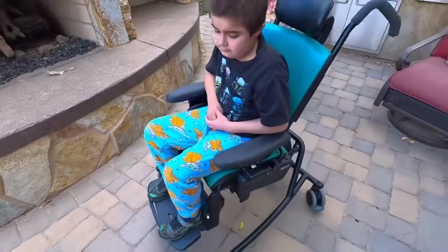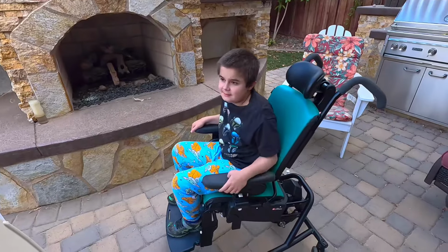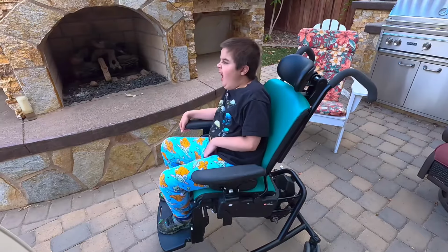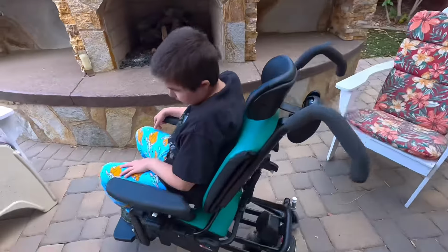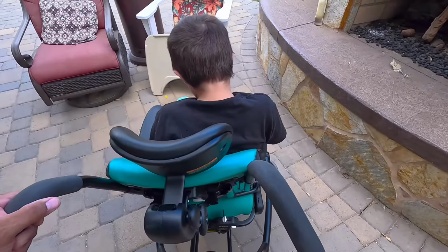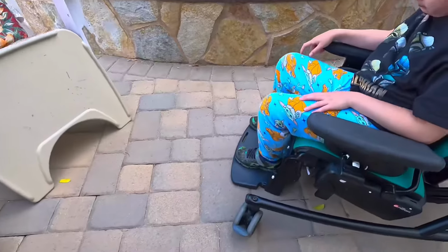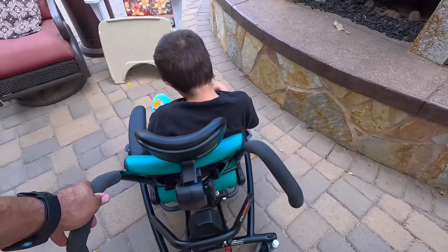Now this is where it's a little different. Billy has lost a lot of strength, and so in order for him to get out of the chair in the best way possible, he has to be precisely 5 pumps from floor level. So the first step would be to drop the chair all the way to the ground level, which we'll do right now. And you can see that the chair is all the way at the ground level, and now we'll pump it 5 times.